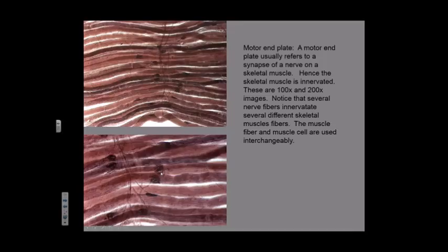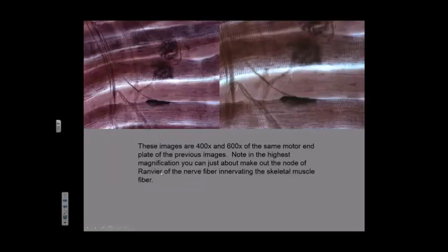And every little tiny dot you see is a synapse. And here it is under higher power. Now that it's under higher power, we can see the striations a little bit better. We can see the black dots. So here's one right here. Here's a wire coming in.